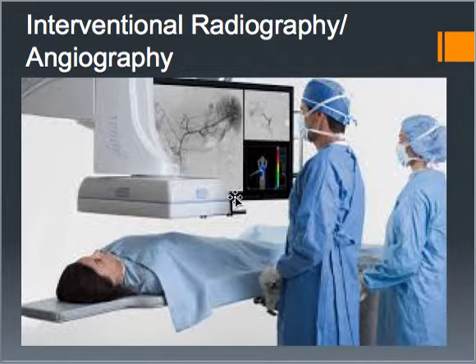So this is a picture of an interventional radiologist and the technologist in the room with the patient on the table. They've got the x-ray machine here and the monitors behind them so they can visualize what's going on during the procedure. So as you can tell by this, the monitors are very big, they're high quality, so that the doctor can see very small details while he's doing the procedure. And I'll break down how they do it and what each person's role is and things like that as we get a little bit deeper in.